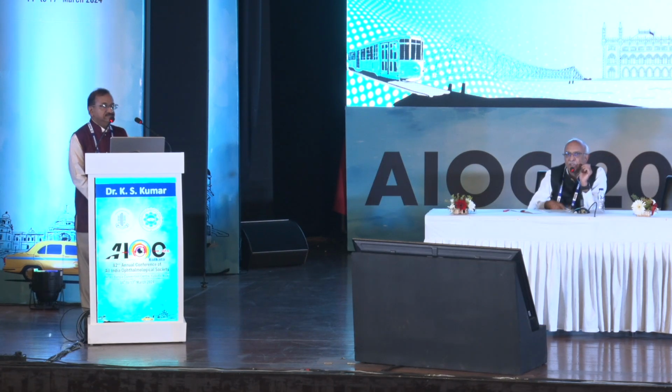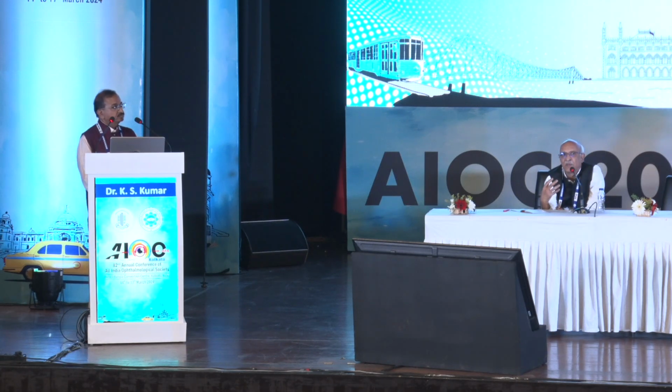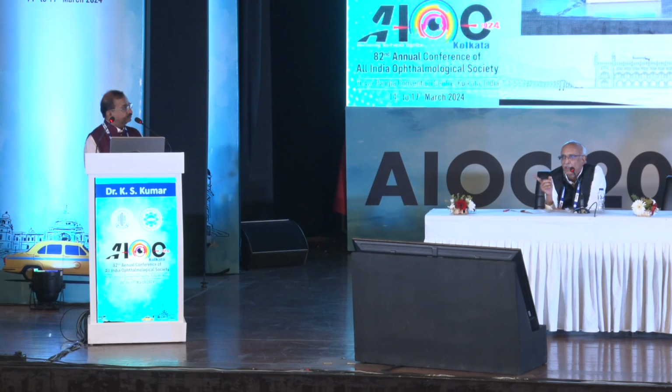See, the fact that you can see that there is a limbal ring shows that I have tried removing it from inside. I have done a vitrectomy because the foreign body was visible from inside also. So this was a patient who underwent surgery for almost an hour. After 1 hour, we gave up and did the extraocular retrieval method. So it was mostly extraocular, which we could not identify before surgery.